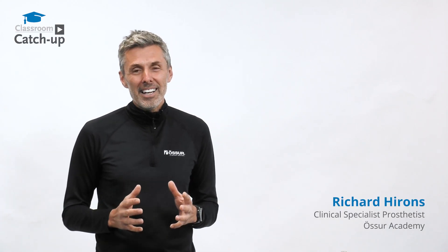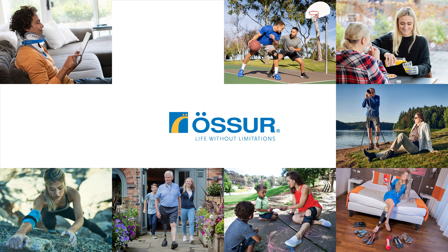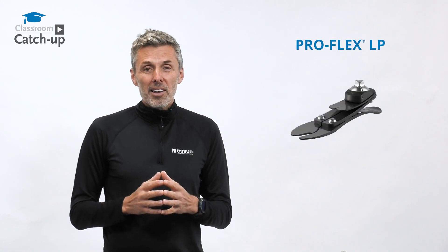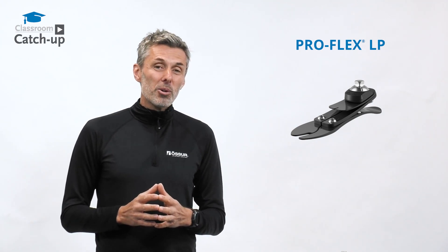I'm Richard, a clinical specialist prosthetist with the Ostra Academy, and today we're talking about the Proflex LP. The Proflex LP, like all the feet in the Proflex family, features what we call a tri-bladed design. Let's take a closer look.